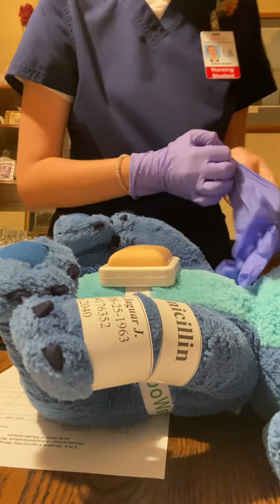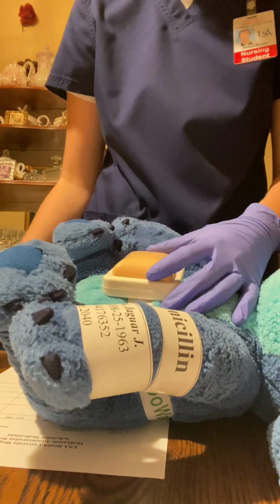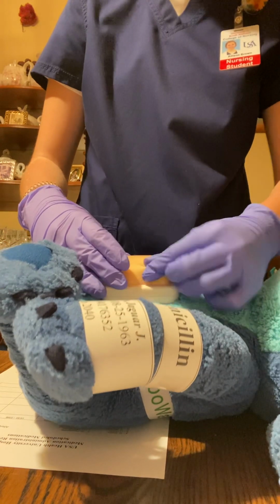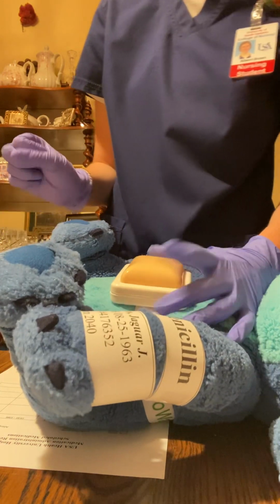And we're now going to look at my patient's skin integrity, and since it's subcutaneous, we are going to be giving it on his stomach, 2 inches around the umbilicus, and we will be going at a 45-degree angle as well, since I can only pinch 1 inch.